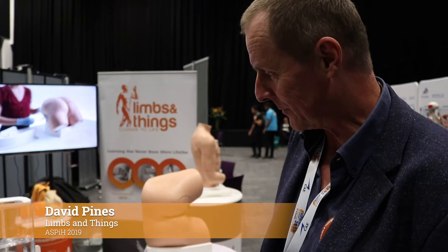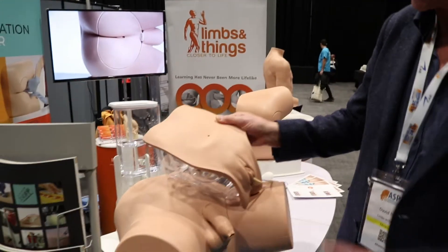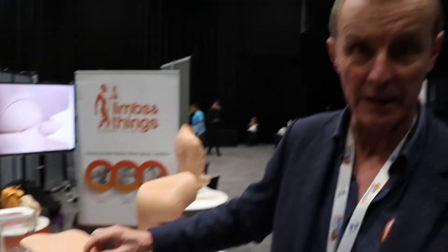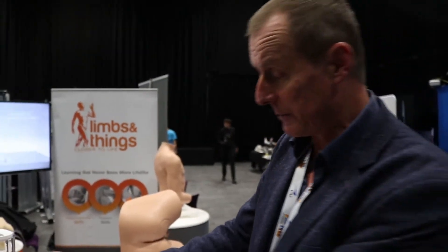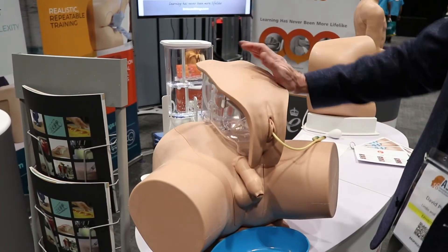This is the new Limbs and Things catheterisation trainer. It comes in male and female, and there is an option for doing supra-pubic catheterisation — both pre-ported for exchange of a supra-pubic catheter, or there's another module we don't have here for doing ultrasound-guided primary supra-pubic catheter insertion.